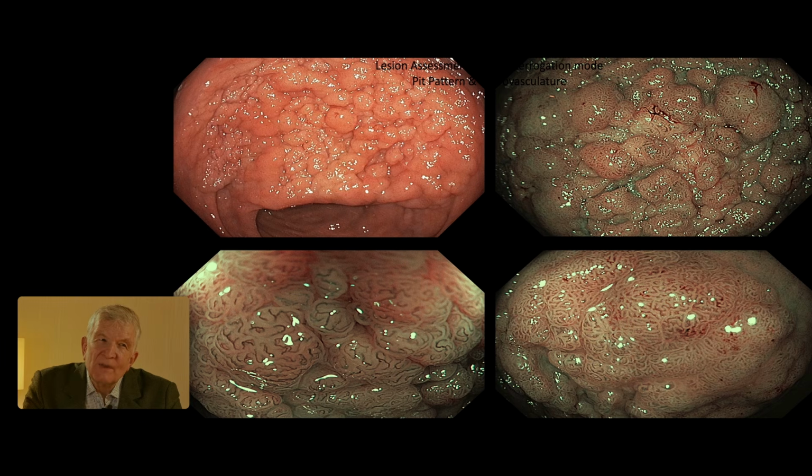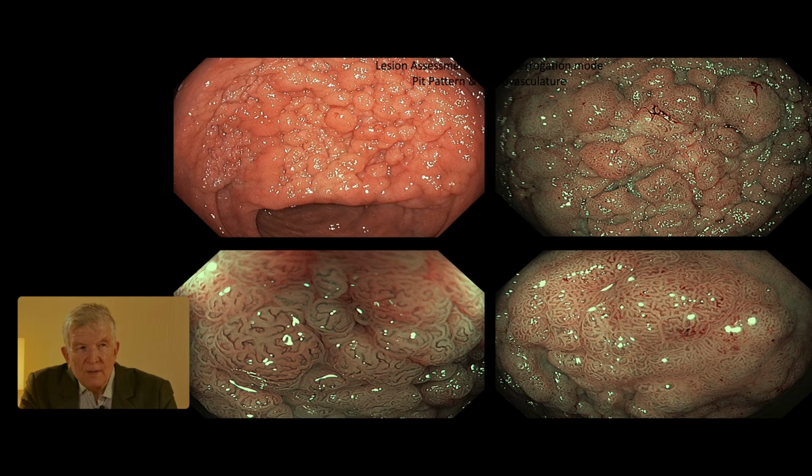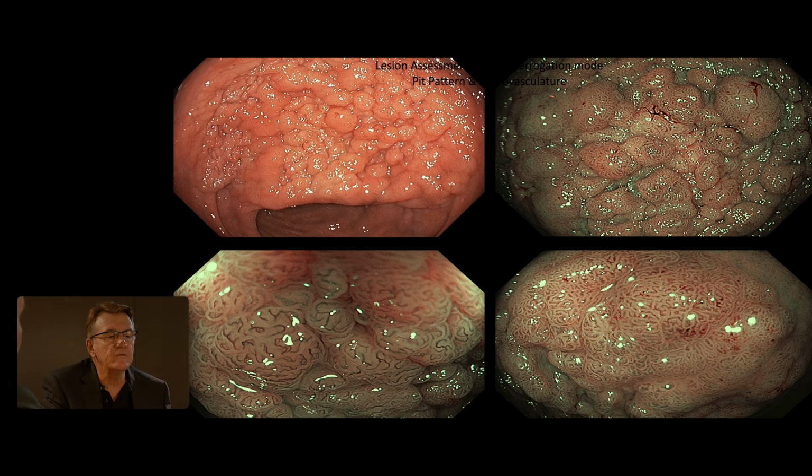You have to do this with the entire lesion, square centimeter by square centimeter. With focal interrogation, we want to focus on any area that's either depressed or a dominant nodule and observe the pit pattern in that area. So you take your overview and then some random close-ups? No, you say, right, well, that's the biggest nodule. So we go and look at that.